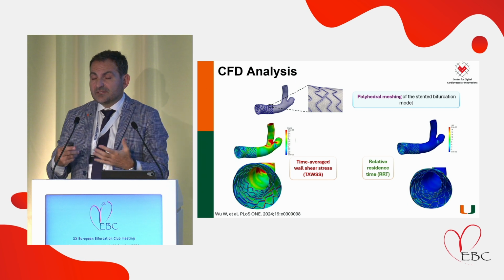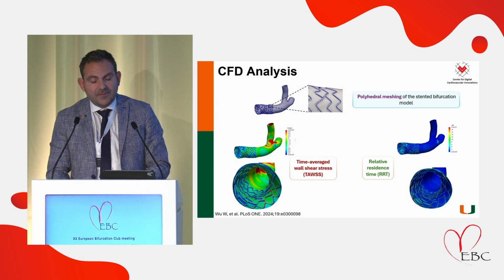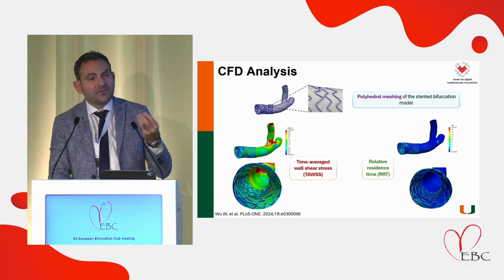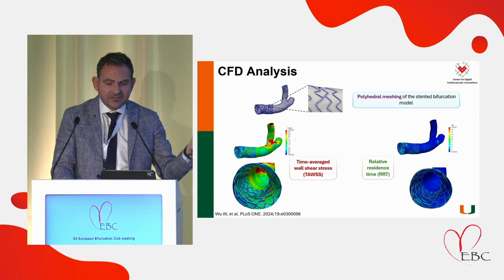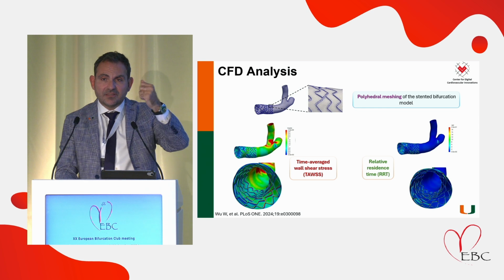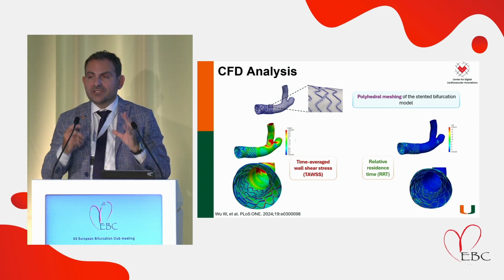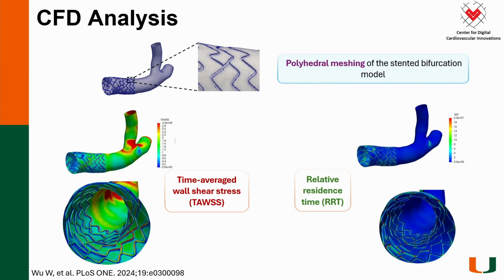We can do this not yet in real time, if you want. We have the computer power nowadays to do all those things, and they can give us important information about the shear stress, the residence time, following Gianluca's talk as well, on how the hemodynamics are configured in particular stents, which can give us the opportunity maybe to optimize the stenting and improve the outcome.